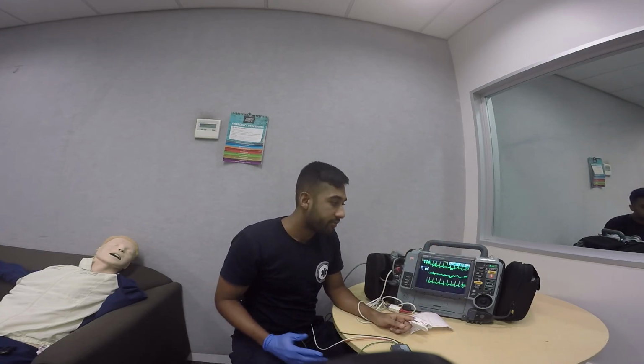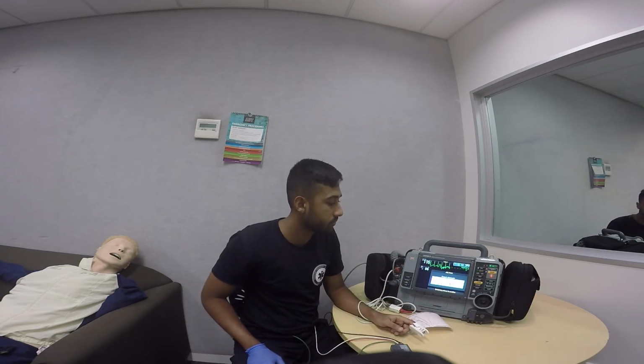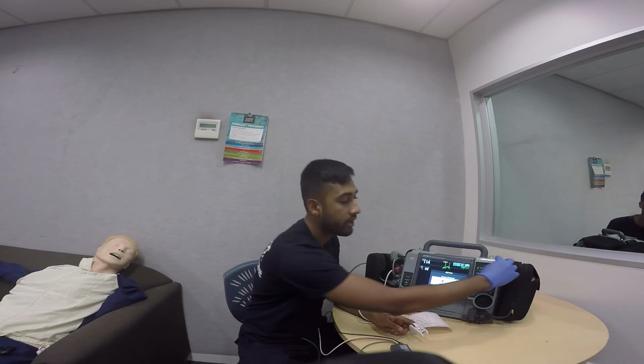To change the LifePack back into AED mode, we just have to hit analyze, connect electrode, and to turn it off, we just hold down the home button.